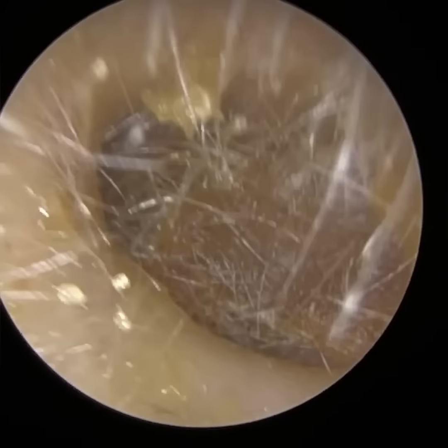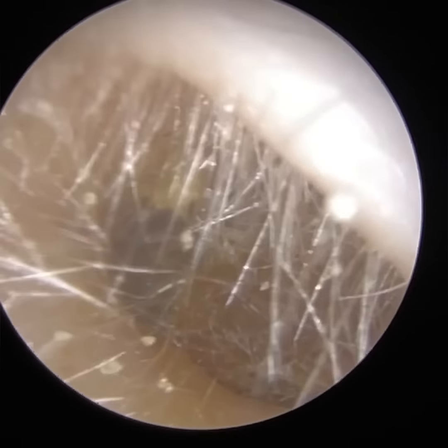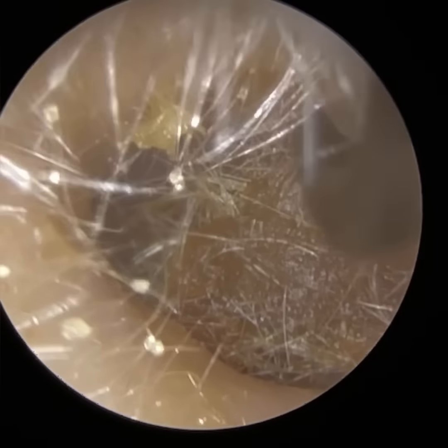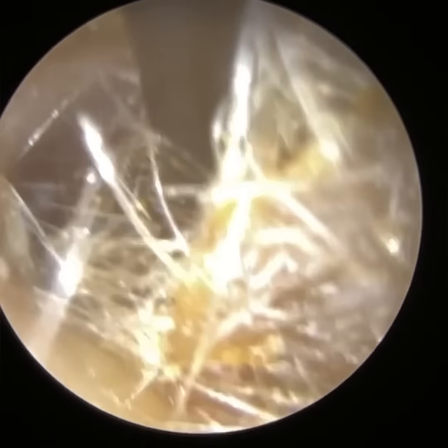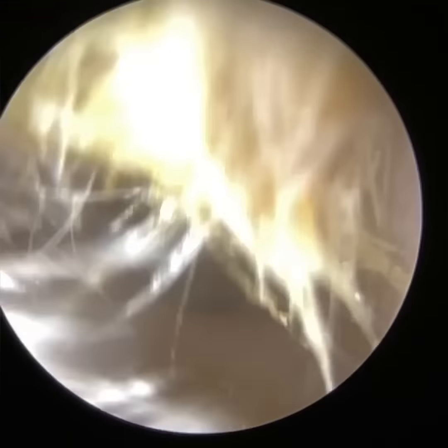So this is patient two. Patient two attended reporting a blocked left ear. You can see there is some matted hair with the wax and keratin, but there was quite a big gap at the opening of the roof of the ear canal. You can tell this is probably a bit of an older video — I'm using the old St. Bart's ear hook. You can see just how broad this one is at the tip compared to the previous one.